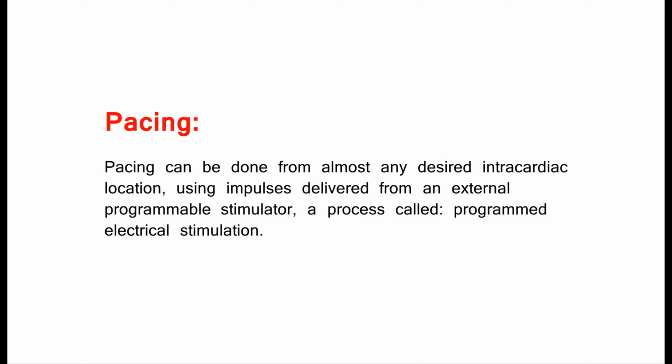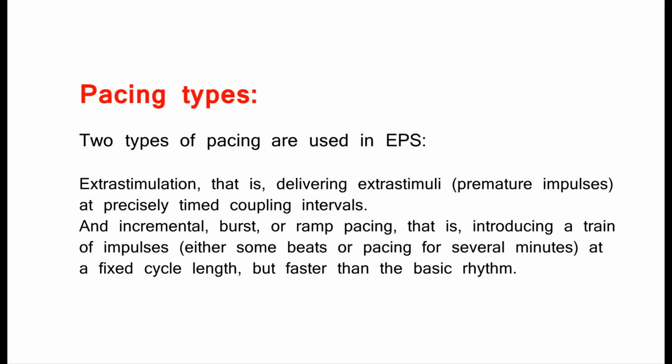Pacing. Pacing can be done from almost any desired intracardiac location, using impulses delivered from an external programmable stimulator, a process called programmed electrical stimulation. Pacing types.